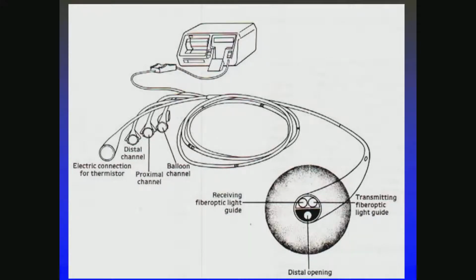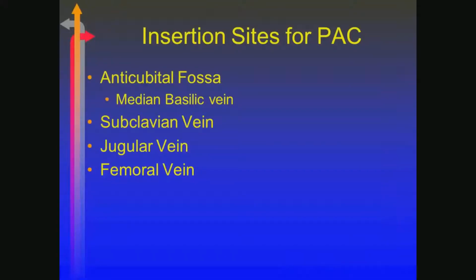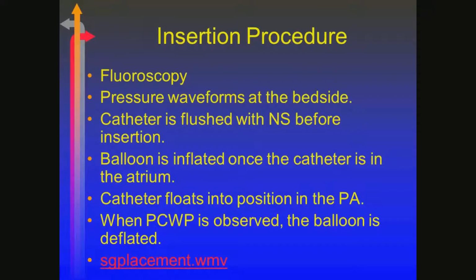Here's an example where you have a transmitting and a receiving diode that will interpret how much of the hemoglobin is saturated with oxygen. We put these in really any large vein, although you don't use the antecubital that often. Subclavian, jugular, and femoral are probably where you'll most often see them placed. You can do it under fluoroscopy, but most of the time it's done at the bedside, watching the pressure changes as it's inserted.